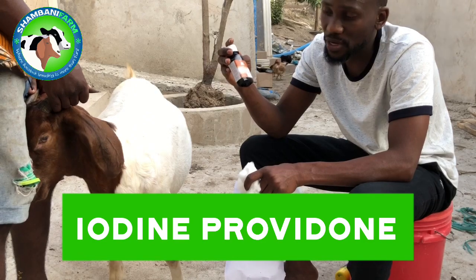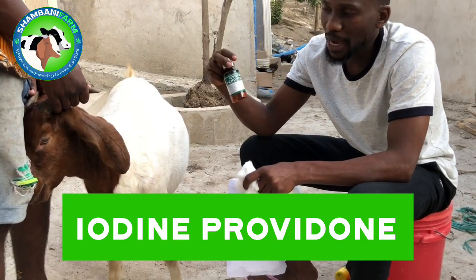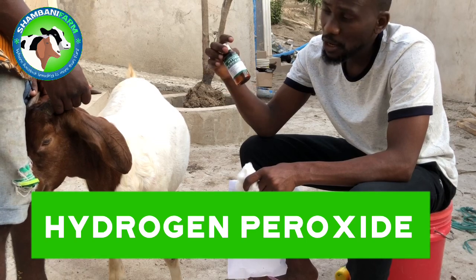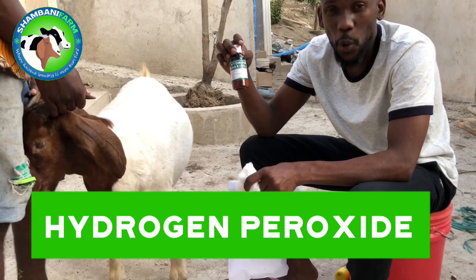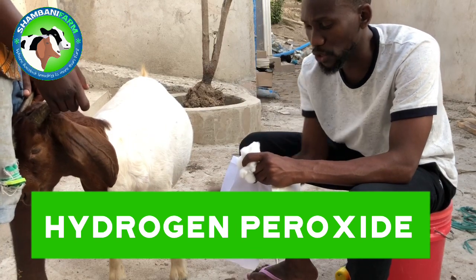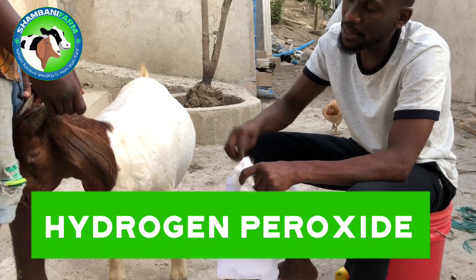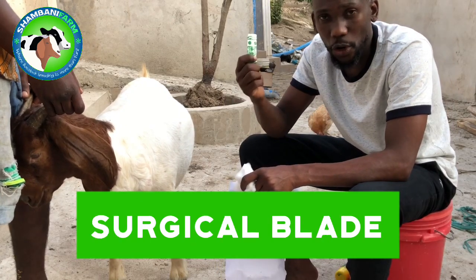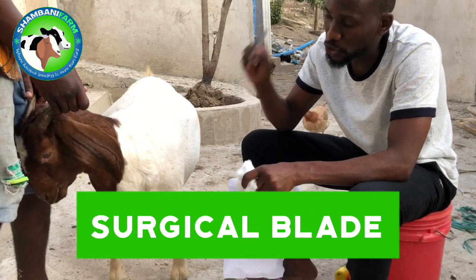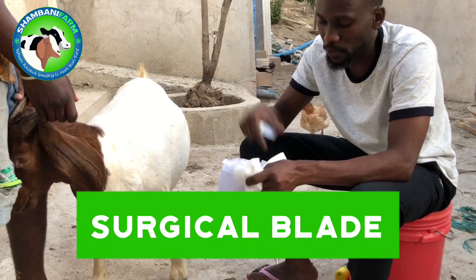You need a weak iodine solution. You will need hydrogen peroxide for cleaning the wound. After we open it, you'll need this to clean up the wound, to drain the pus. You'll need a blade, a surgical blade, for you to create an incision on the skin of the animal.